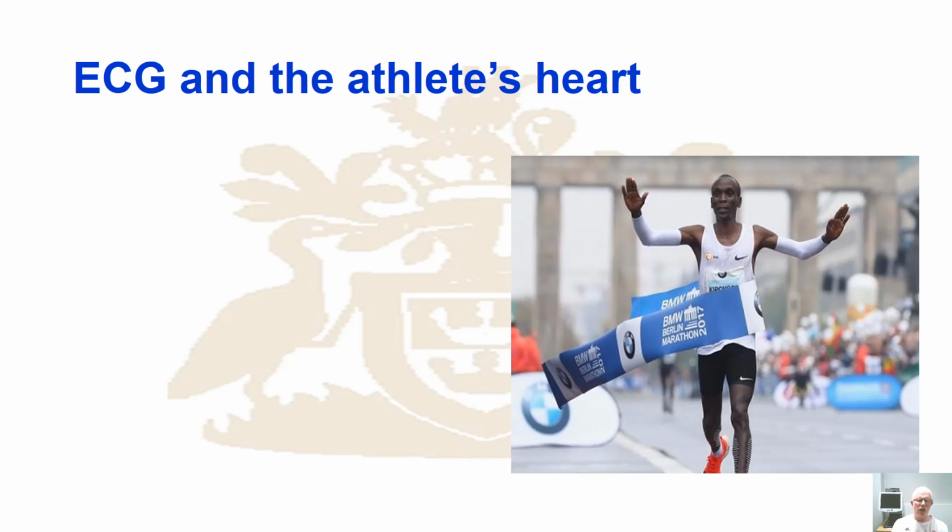And so the ECG has to be interpreted differently when we're dealing with an athlete's heart, because it's not that the heart works differently, it's just that it has been pushed in such a way that it will give different responses.